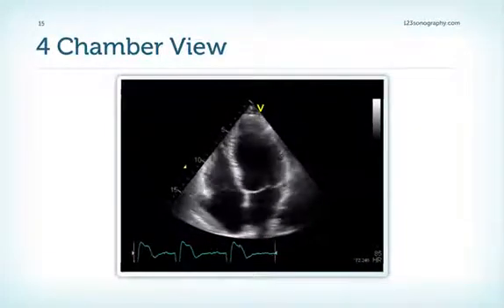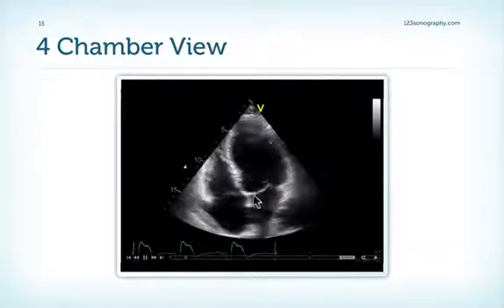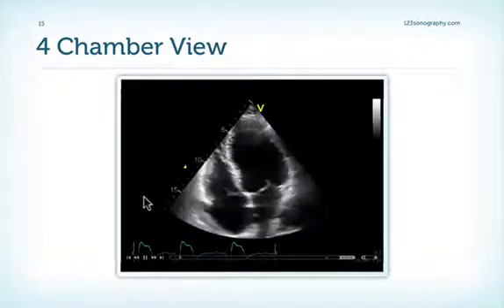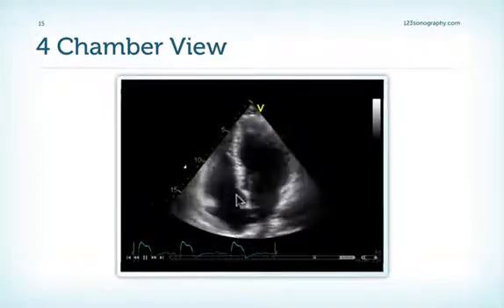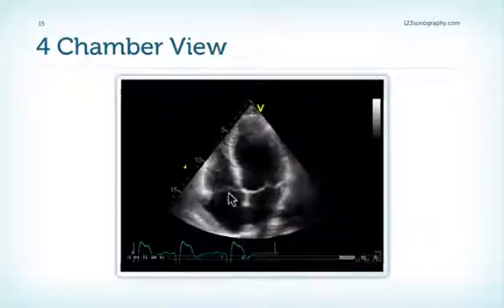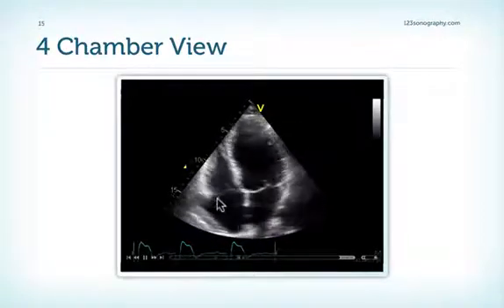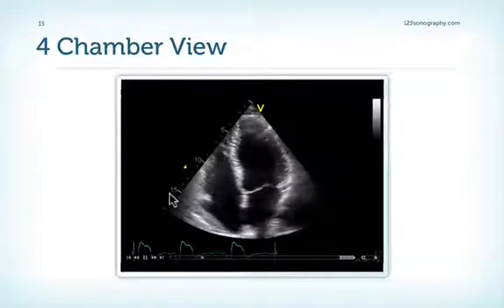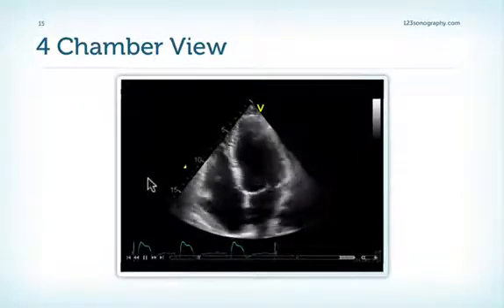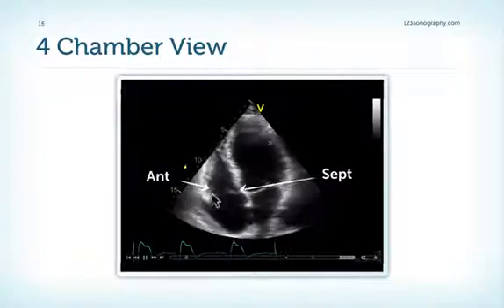The four-chamber view again, with the tricuspid valve visible. Which leaflet is this and which leaflet is this? The leaflet attached to the septum must be the septal leaflet. The other one here is the anterior leaflet — unless you tilt the transducer far down until you see the coronary sinus, in which case you would have the posterior leaflet. So: septal leaflet and anterior leaflet.